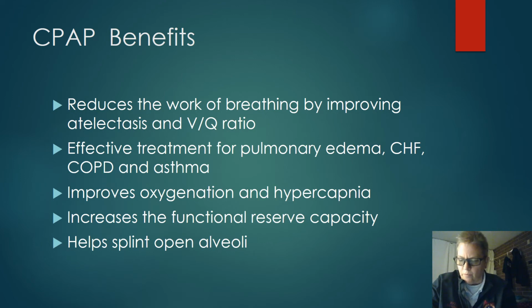So what we have to realize, though, is that peak inspiratory pressure is going to be your inspiratory pressure, that pressure support that you dial in. So say we'll do that 10, and then that CPAP we set at 5 usually. So that peak inspiratory pressure for that CPAP is actually going to be that 5 centimeters of water pressure additive with the 10 pressure support. So that peak airway inspiratory pressure is going to be 15 centimeters of water pressure.